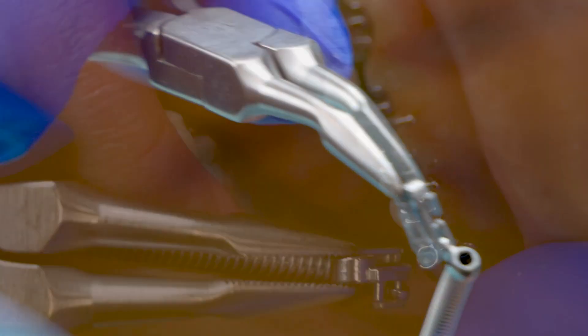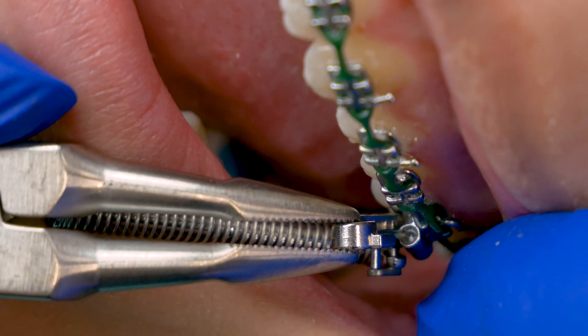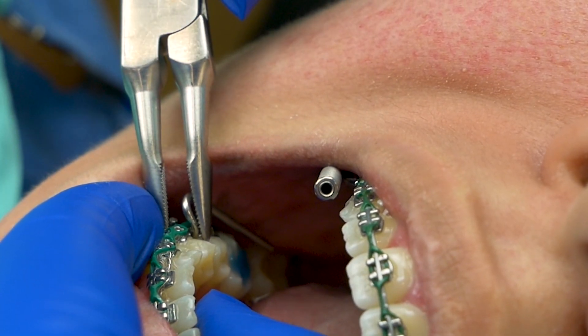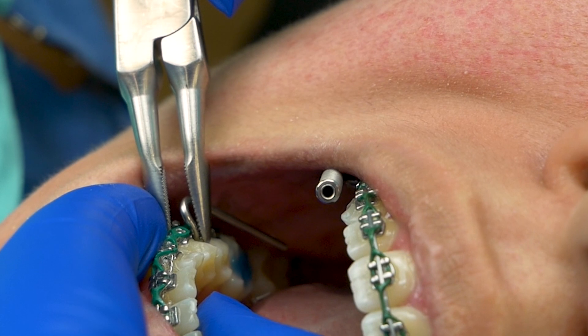Unlike other appliances, Forsus do not require you to do any replacing or tightening. They are placed in one simple appointment and immediately start working to fix your bite.